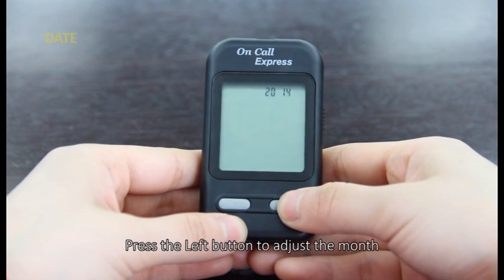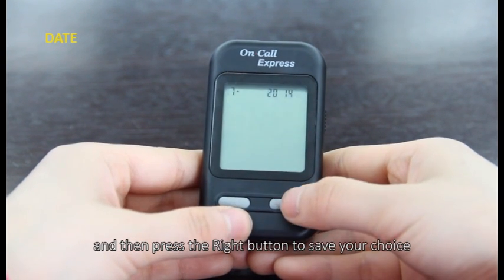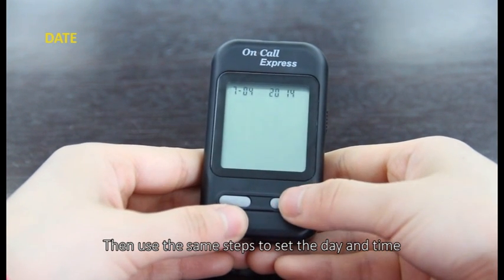Press the left button to adjust the month, and then press the right button to save your choice. Then use the same steps to set the day and time.